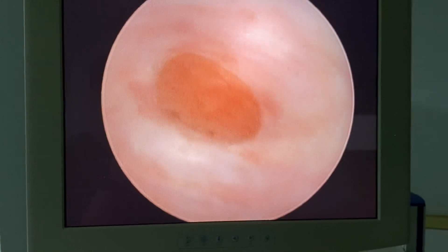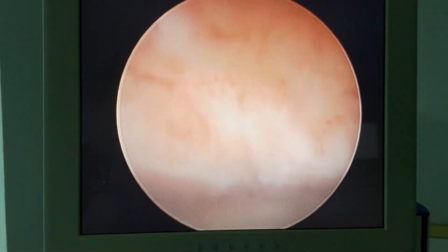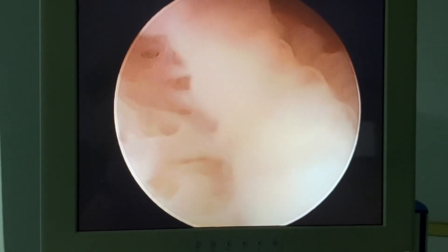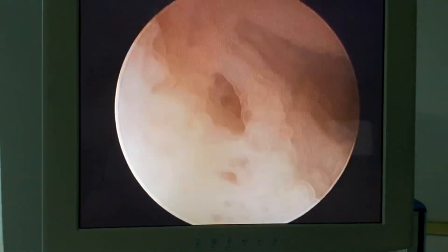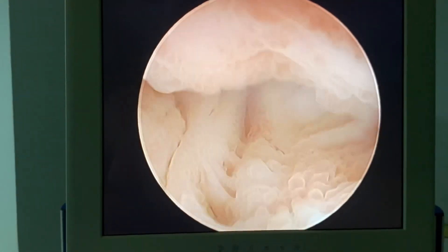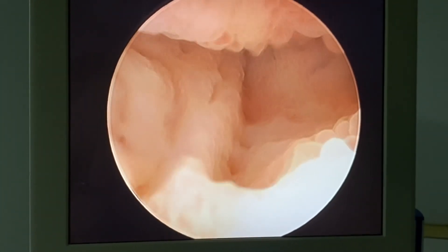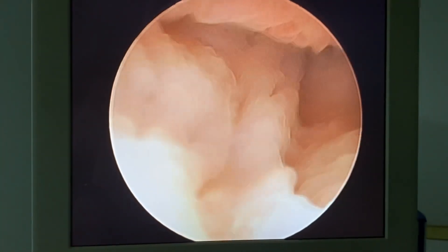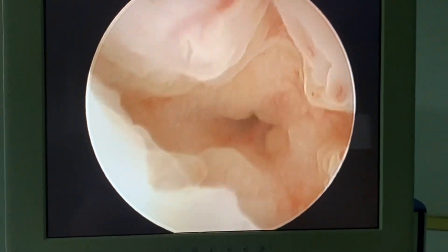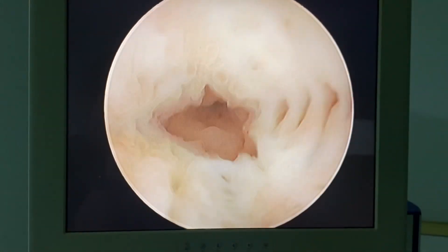You can examine the outer surface of the cervix and then go inside to see the endocervical glands and mucosa — an opportunity not available with standard colposcopy. I hope I've made it clear what vaginoscopy means. It is totally different from the classic published technique, and then we can go slowly and reach the internal os.